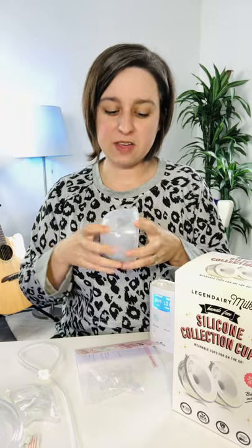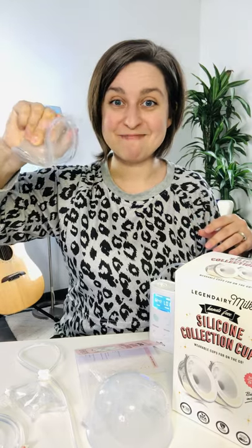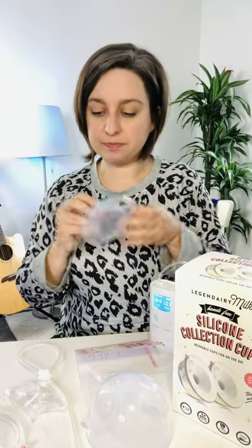You get two cups and then two different size flanges. It comes with 24 millimeter and 28 millimeter, and the coolest thing about these flanges is that they are silicone and squishy — they're not the hard plastic like some of the other ones.